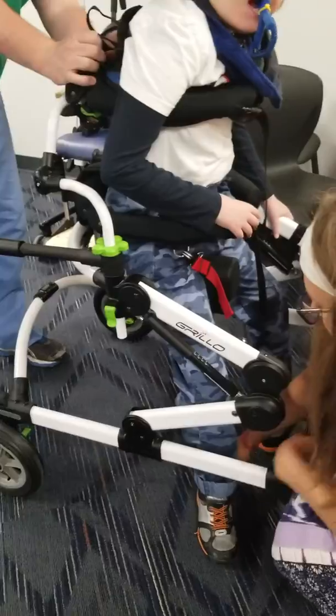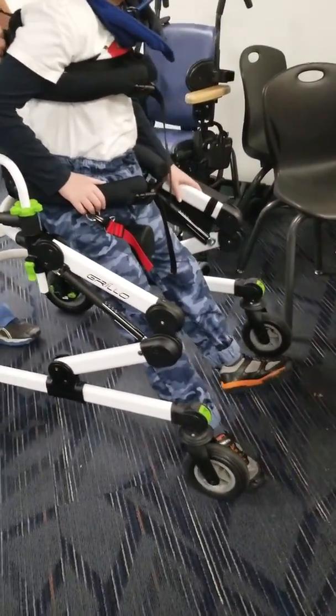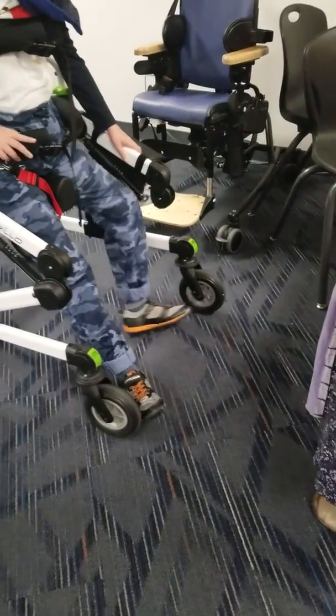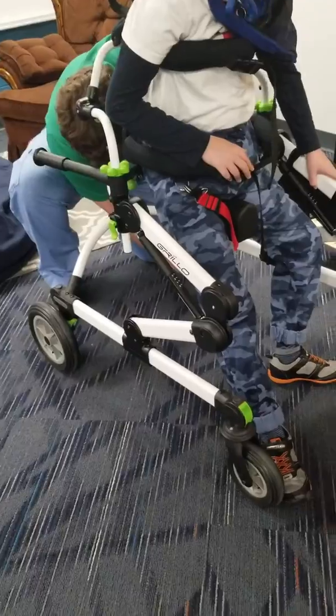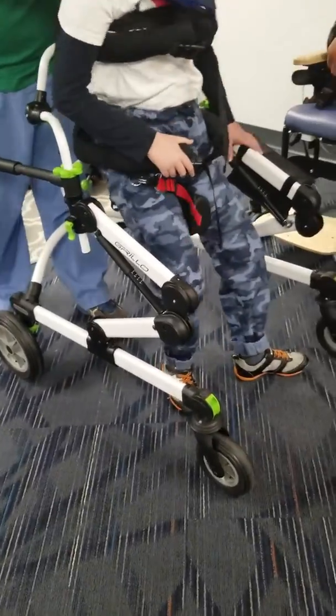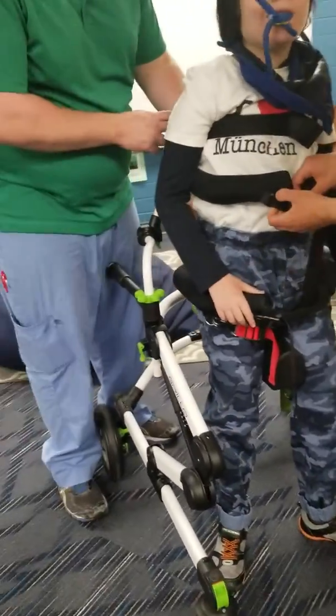You know how those wheels sometimes you have to... As a matter of fact, you might once or twice. Not with this, but I mean other things. Yes. Mr. Aaron's taking you. I know I'm taking you. All right, so now I can put the brakes on again. Or if you have another person here, all right, let's stand right up. Can I buckle? Or do you want me to hold? You can unbuckle. I'll hold them.